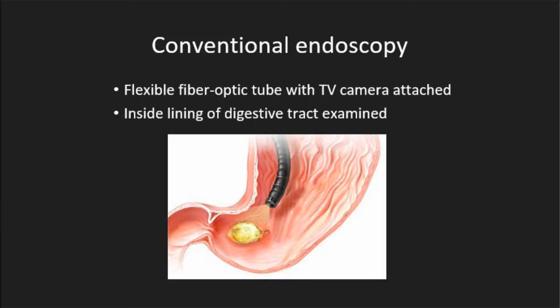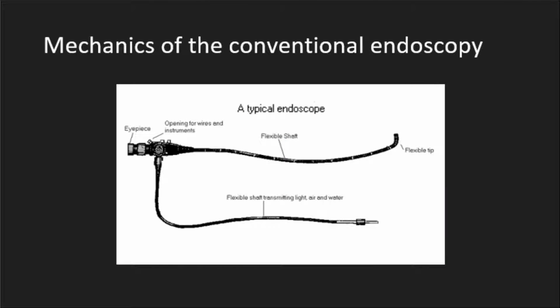During these procedures, although they are minimally invasive, mild sedation or pain medication can be administered to ease any discomfort for the patient. The conventional endoscope is made up of a long, flexible tube, light, lens system, eyepiece, and an additional system that enables other medical instruments or manipulators to be passed through the endoscope into the body. Attached to the endoscope is also a small camera, which transmits images obtained to a monitor for close examination.